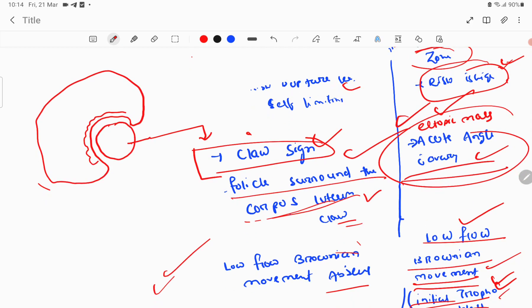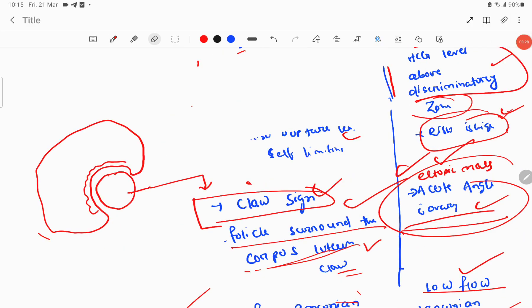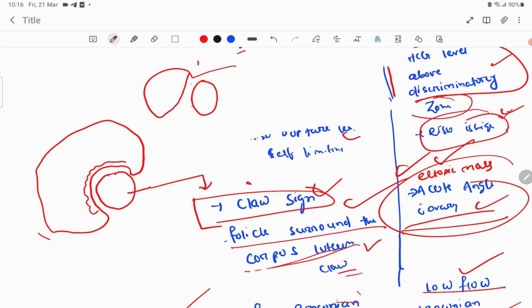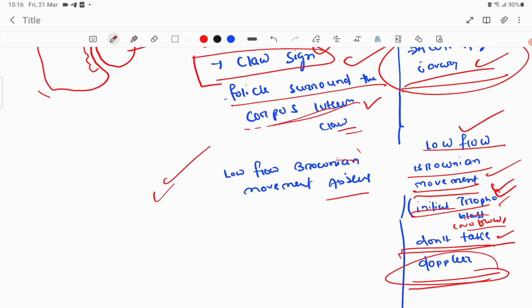In ectopic pregnancy, the ectopic mass makes an acute angle with the ovary — that is, less than 90 degrees. So the claw sign is typically seen with corpus luteum cyst, whereas the ectopic mass forms an acute angle with the ovary. This acute angle is a differentiating feature between corpus luteum and tubal ectopic pregnancy.